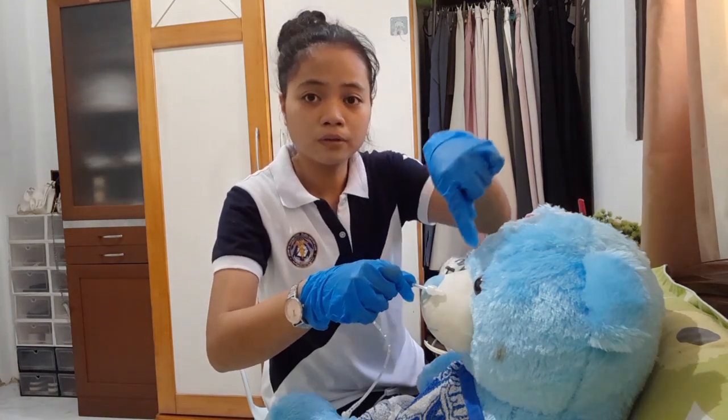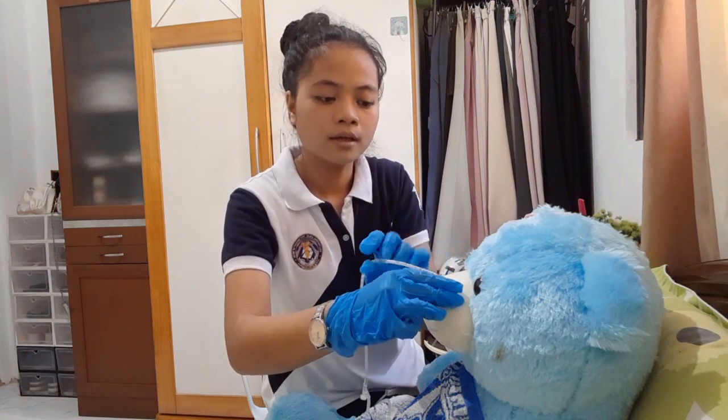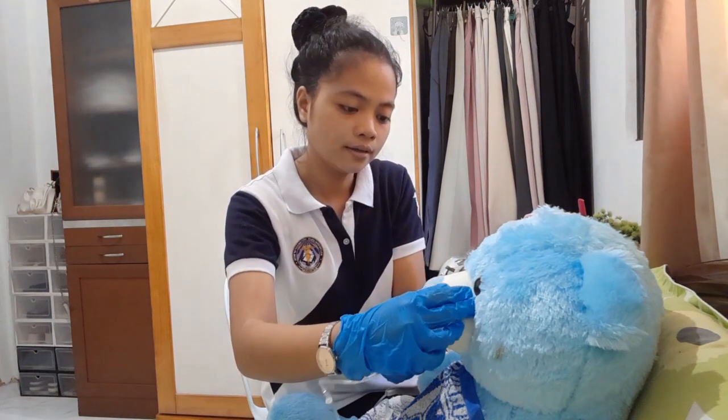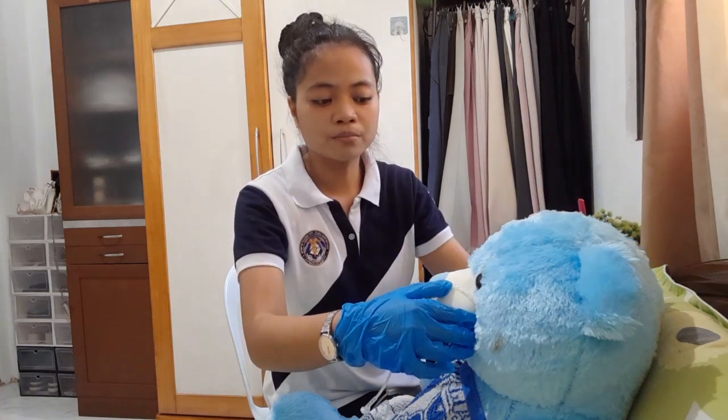So, assuming na lang po na nakaka-insert yung tube. So, insert na. Then, once the tube reaches the nasopharynx, allow the client to lower his head slightly.